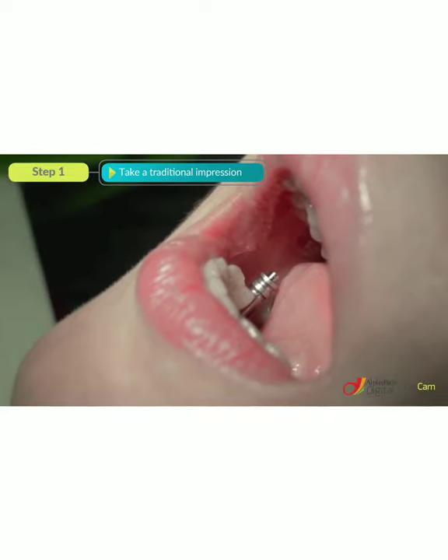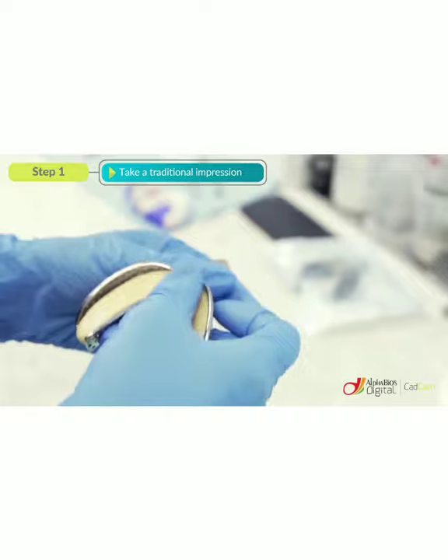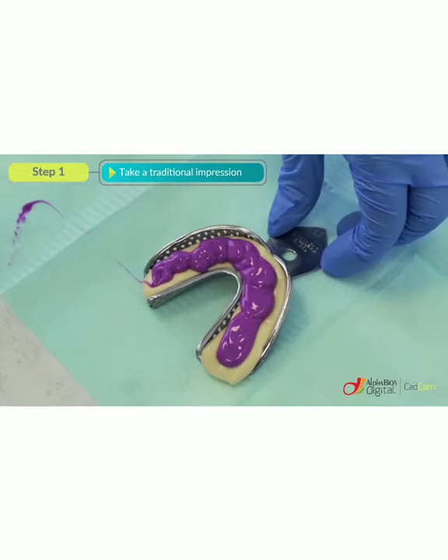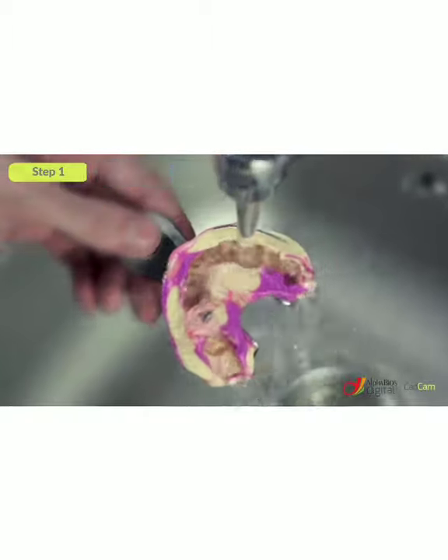Okay, now I will explain CAD and CAM. Step 1. Take a traditional impression. For best accuracy, take the impression at the design restoration level of the implant or abutment. Step 2. Model casting and scanning.